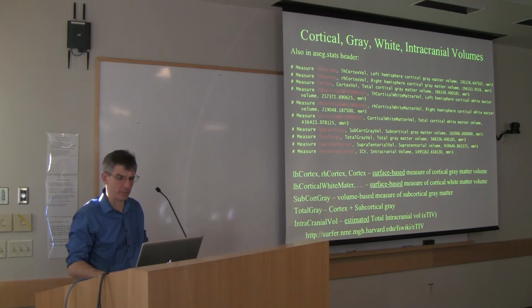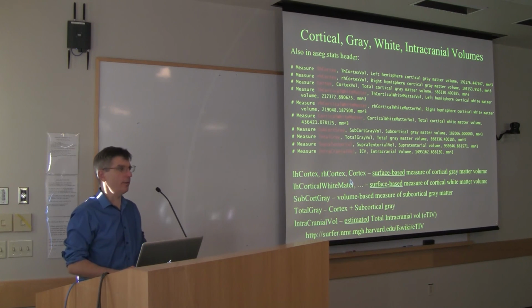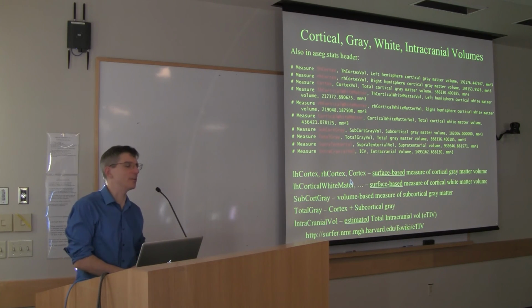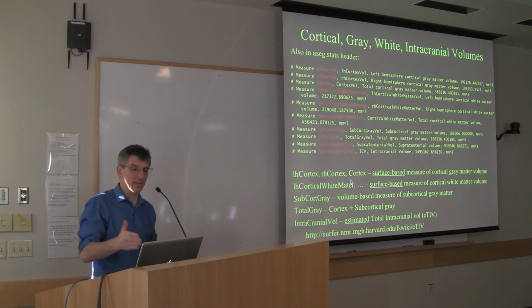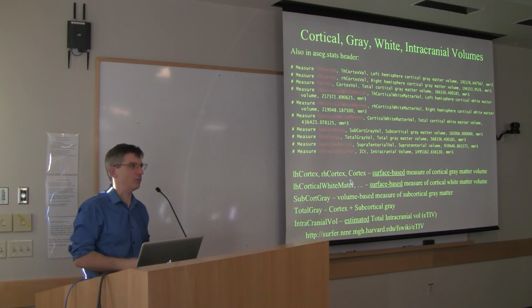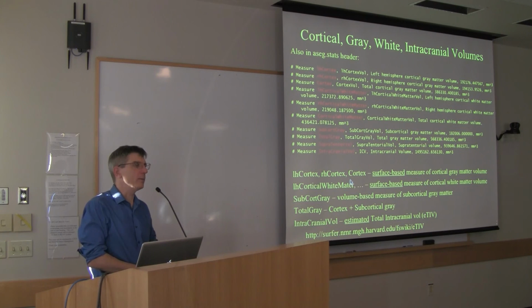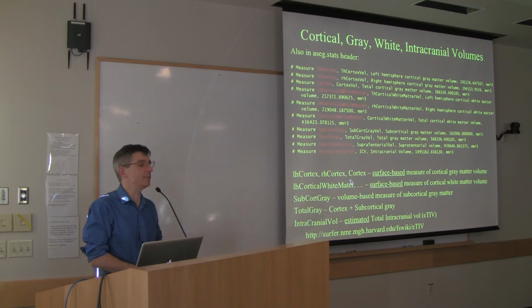Actually, I'll just go ahead and explain it right now, because this generates nothing but confusion in terms of how this number is generated. There's a number that will come out that says intracranial volume or estimated intracranial volume. Where does that number come from? As I mentioned earlier, which you might not remember, you cannot see the skull on typical MRI.